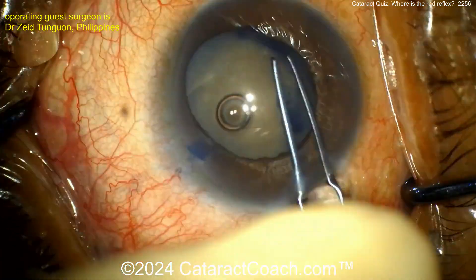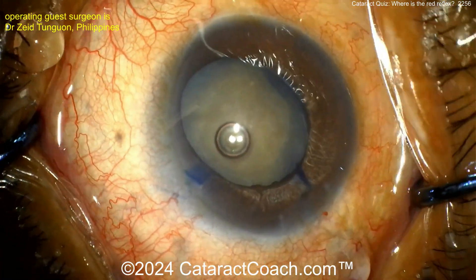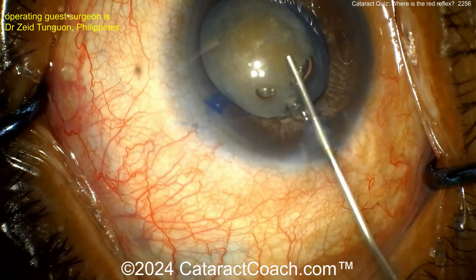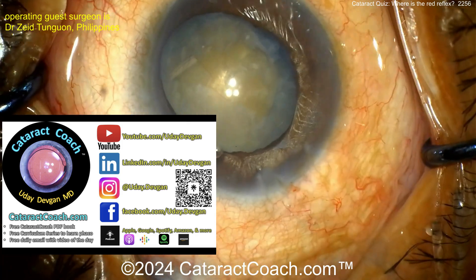It's a generous-size rhexis and now we're going to do some nucleus removal. The challenge here is you're not going to have a red reflex — we already saw that in the title picture. You also have to be on the lookout for zonular weakness.